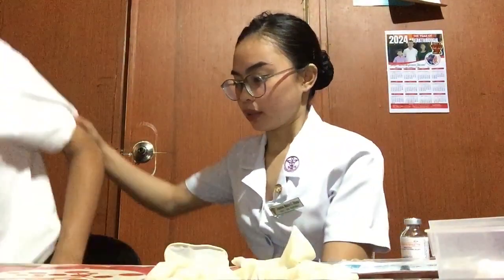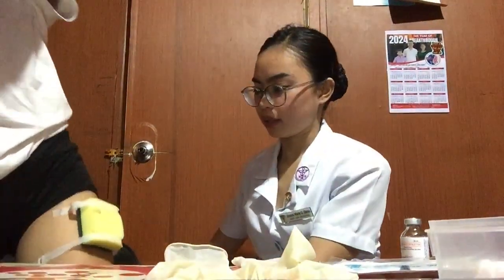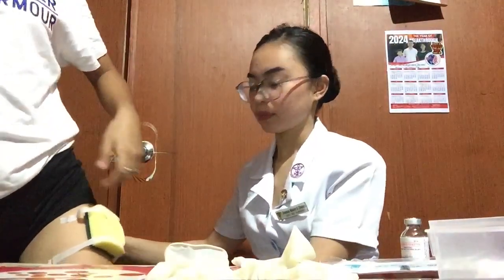Okay, ma'am, can you... If injections are frequent, alternate sites and avoid using the same site twice in a row. Locate the exact site for the injection and apply clean gloves.